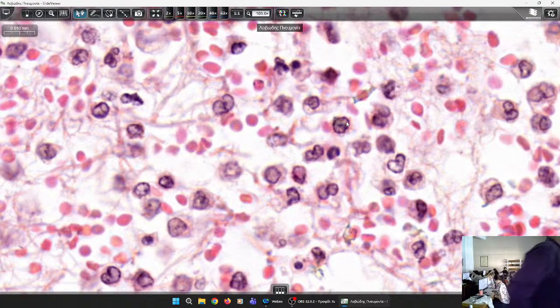So now that I'm showing you the slides, there is no need that I show you the slides in the preparatory lesson for the midterm exam. I have it videotaped so you can look at it. And when we have the preparatory lesson, we'll have the slides of circulatory, gastrointestinal, and liver. Not the respiratory, because that's what we do now.